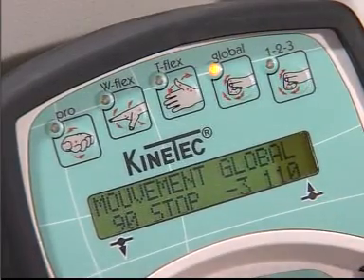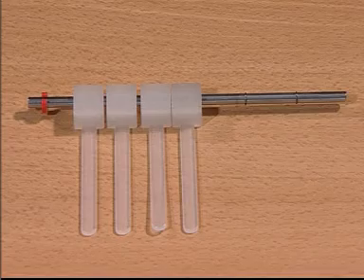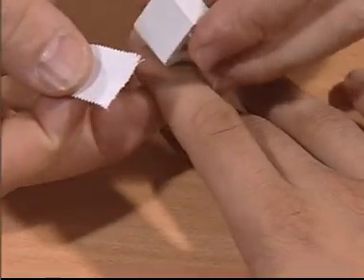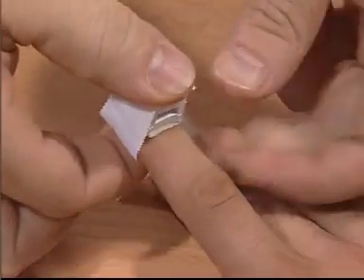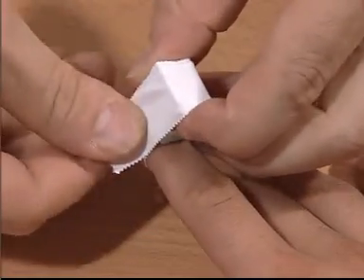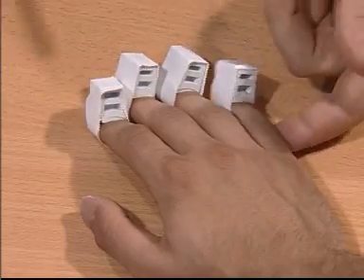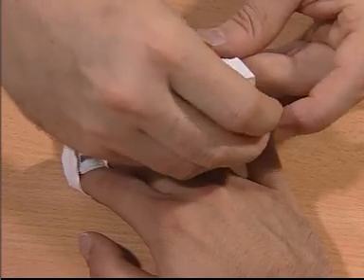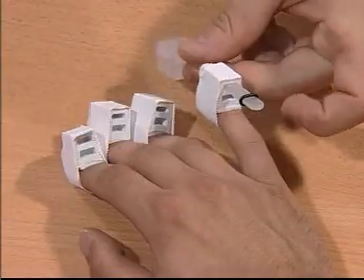For composite fist, these are the attachments: the drive bar with the fingertip attachment. The fingertip attachments, which are separate, we place them over the distal phalanges of the hand. We secure them in place. We insert the attachment in which we will secure the drive bar.